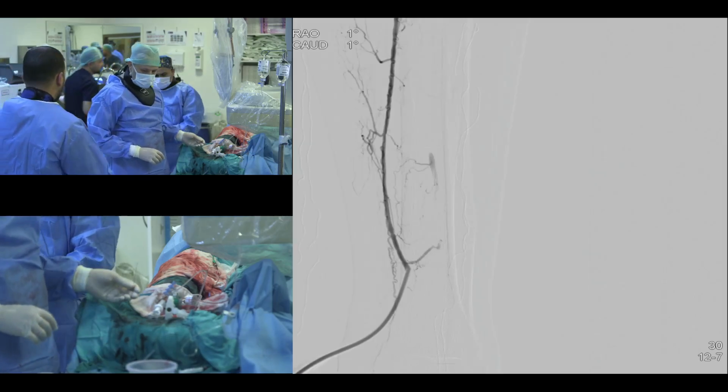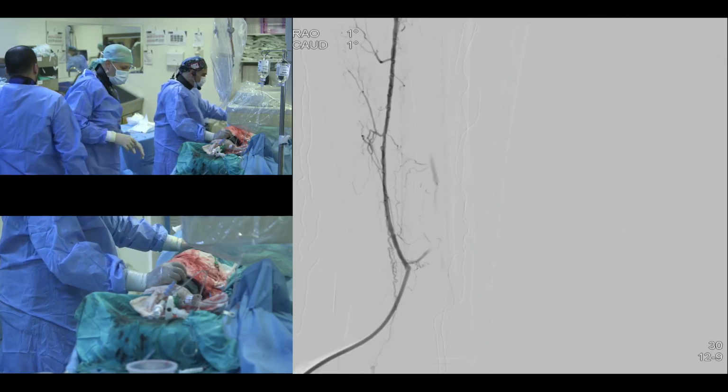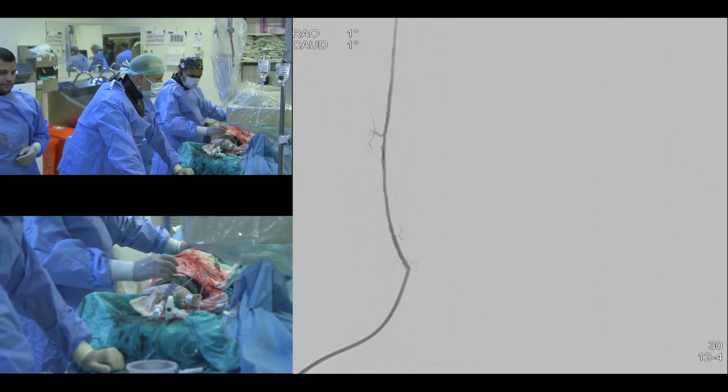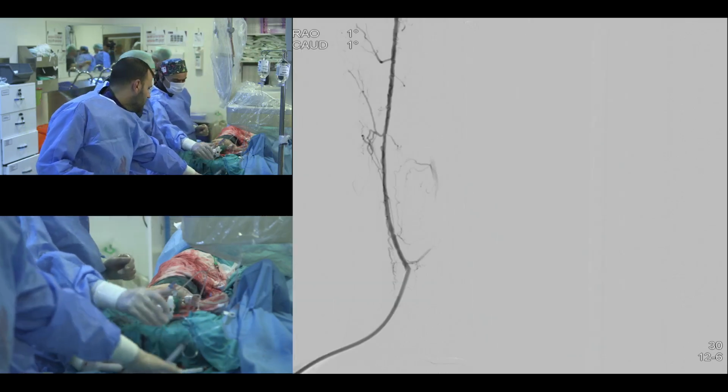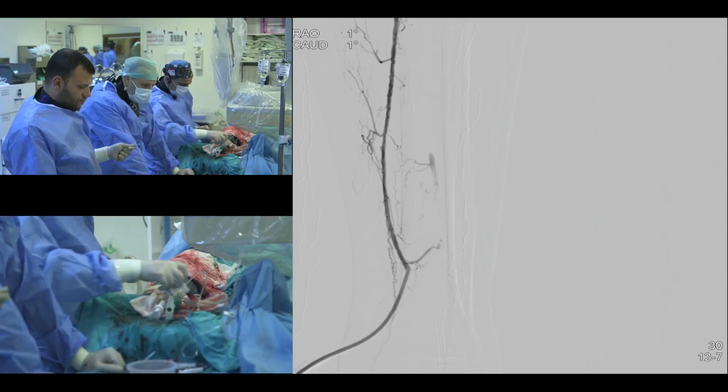This stent was just made available in the States in July. Is it available in Turkey, this everolimus self-absorbable scaffold, Esprit? I think it's made by Abbott Vascular. It's not available in Turkey yet? Okay, so it probably will be coming, but in the States, it just got approved in July.